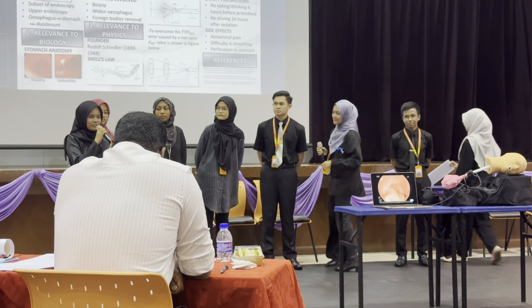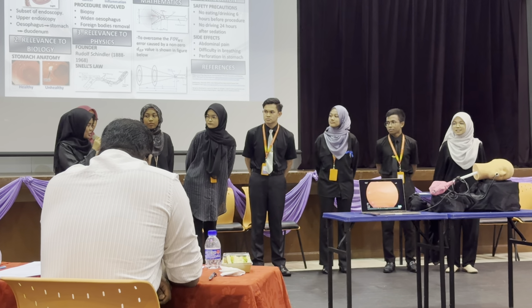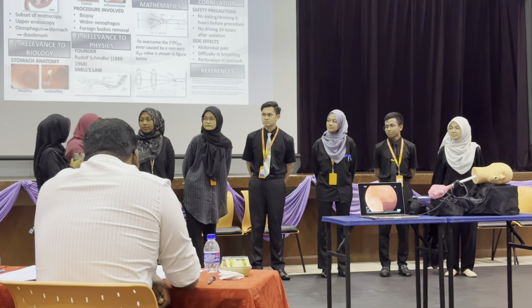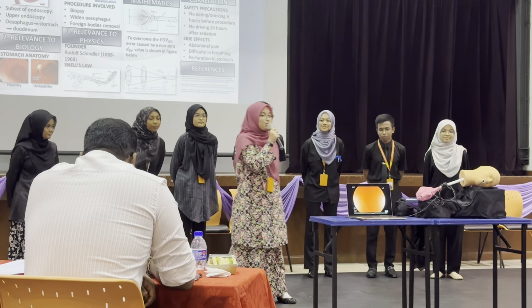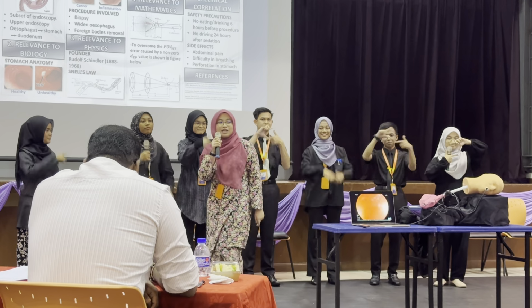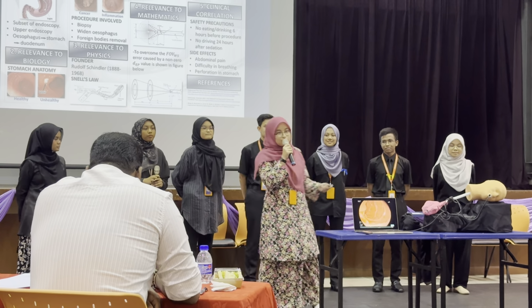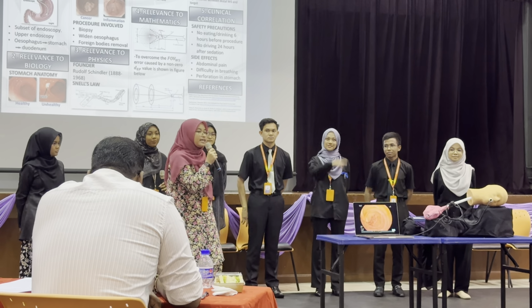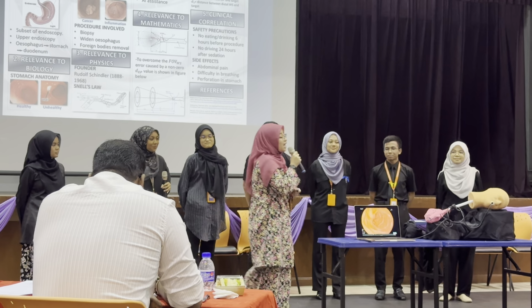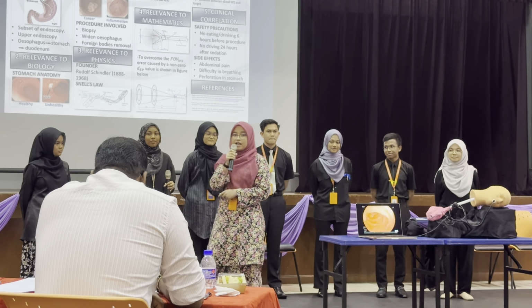Okay, but what's the connection between gastroscopy and mathematics? Let me explain that part. The endoscope operator needs to move and refocus the endoscope obliquely, which makes hand-eye coordination and smooth manipulation more difficult, and it will lead to increased procedure time. As a result, manufacturers are seeking to design endoscopes with a large field of view.